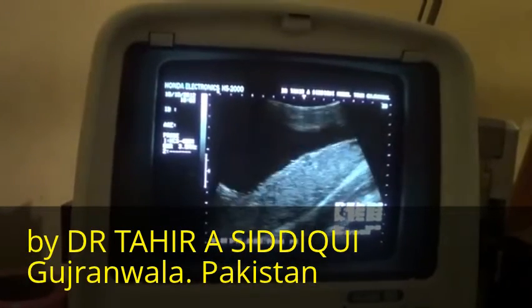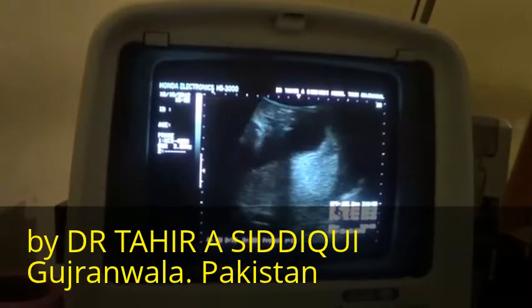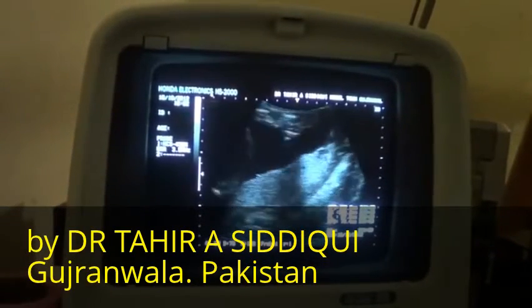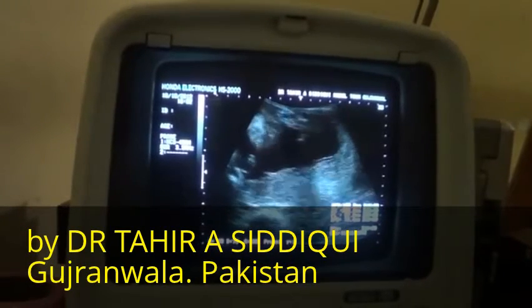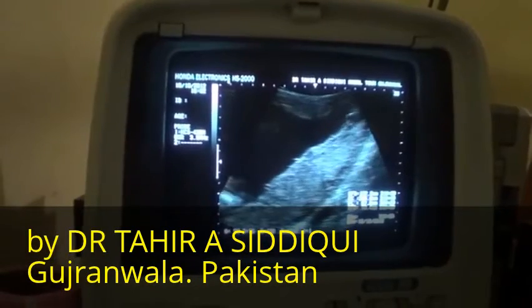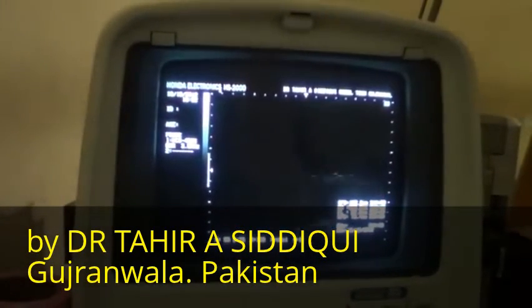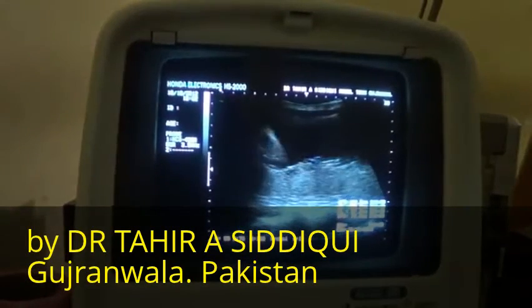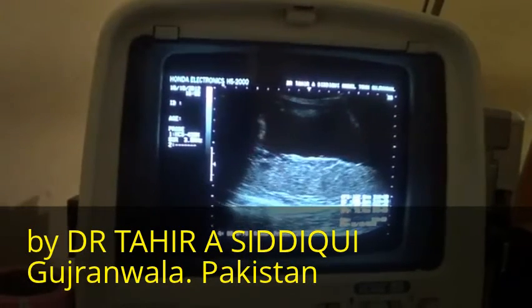So this is grade 2 to 3 placenta, posterior wall.